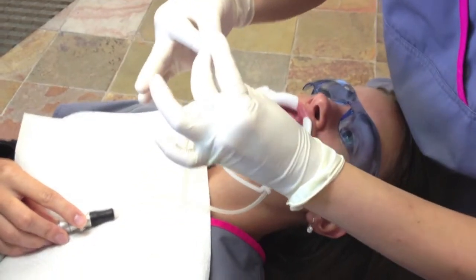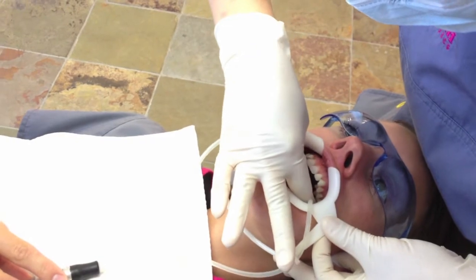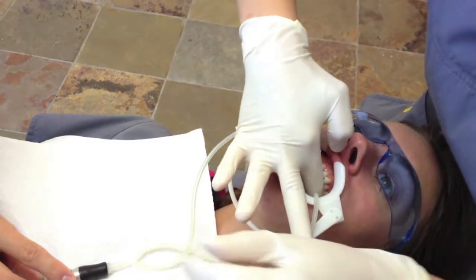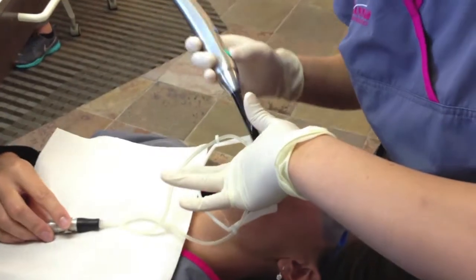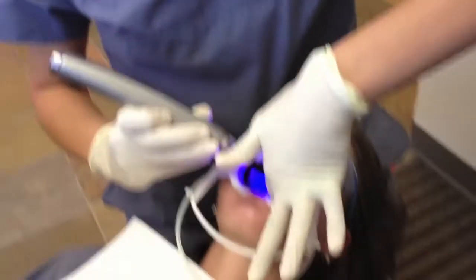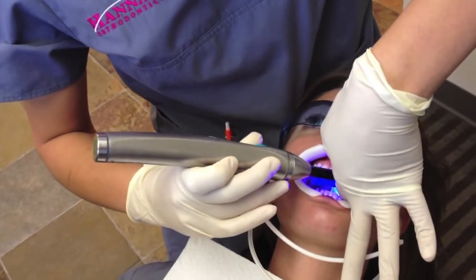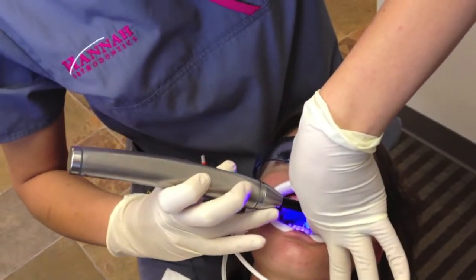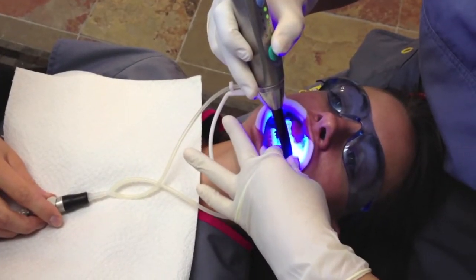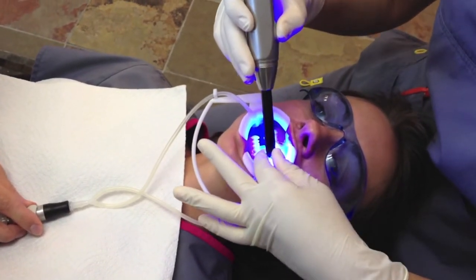We're gonna place our glue on the back of our bracket. I'm gonna have you open just a little bit for me — I'm gonna stick my fingers way back there, hold it like so, and take my light to cure these brackets on there. The glue only hardens when we shine the light on it, so we do it for just a little bit to tack it on. Sometimes it's a little bit warm for the patient.